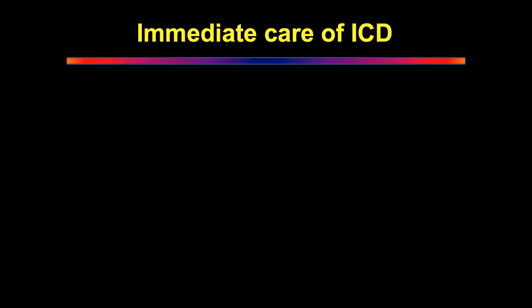Okay, I'm happy with that. I do a different way. I do 1 long stitch which forms a Roman sandal, fishnet. Okay? But that's not important. Can you hear me? I can hear you. Yeah, carry on. So you've tied the drain. What else do you need?